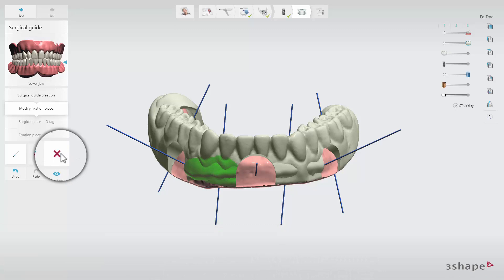To delete the marked areas, click the red Remove icon. Click Preview to see the result when you are done marking.